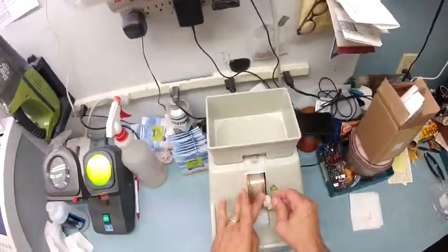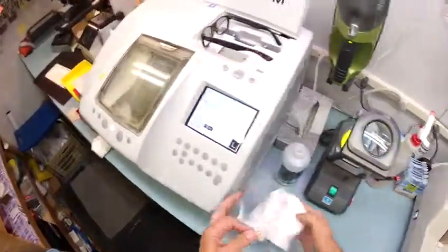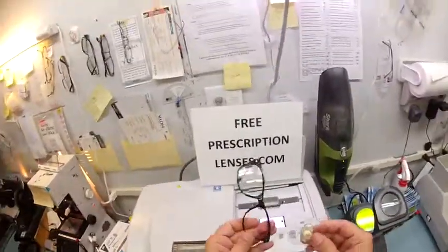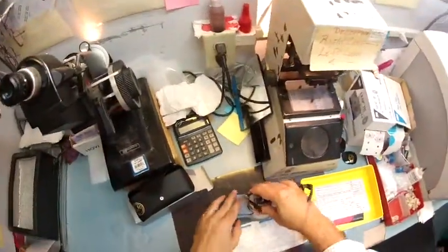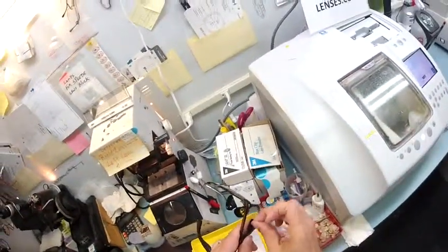So back to the handstone, back to the safety bevel. There is that. I'm going to clean everything off the lens. I'm going to get this mounted. Again, I tuck it in at the outside corner closest to me using my thumbs. Press down, it snaps in perfectly. I'm going to take this block off. Dry that off, throw it back in the bin. Pull the sticker off.